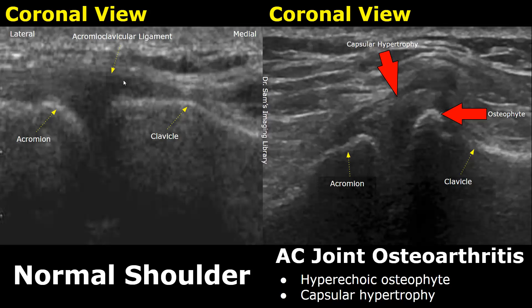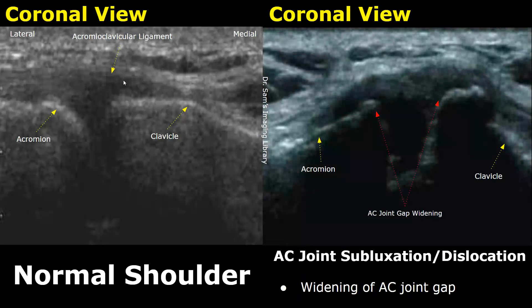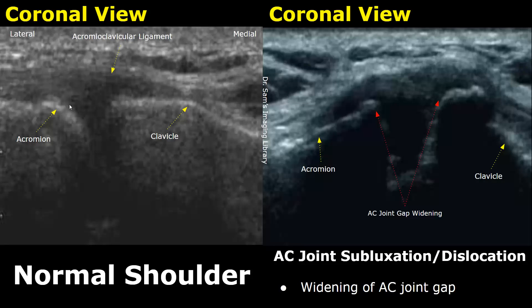Here is a case of AC joint subluxation or dislocation. The usual feature in these cases is widening of the AC joint space, and we can see it is much wider than in the normal case.